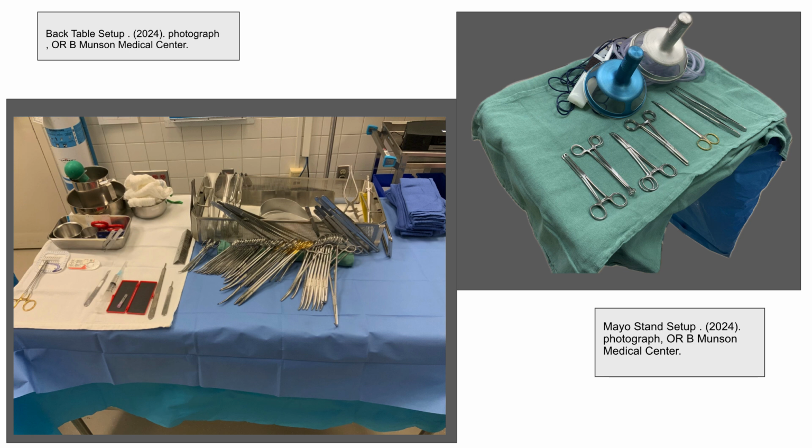The back table setup consists of the irrigation, laps, various vessels for liquids and medications, towels, suture and needle holder, blade, knife handle, sharps holder, bandage scissors, timeout sign, and the instrumentation set. The Mayo setup includes the light handles and ESU and Bovie tips, as well as the items needed for the beginning of the surgery.